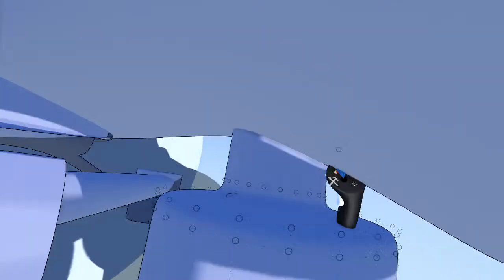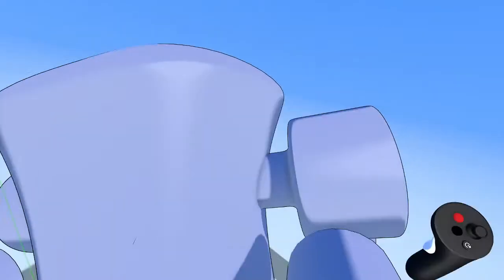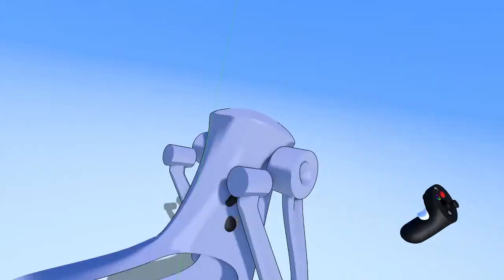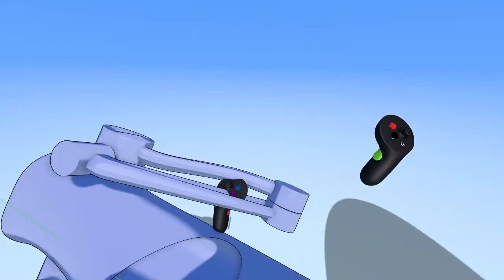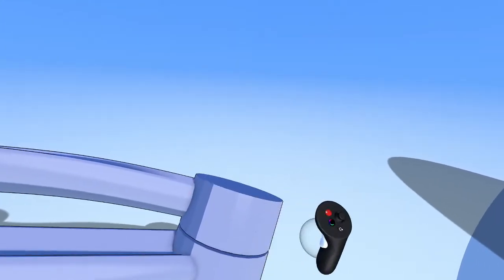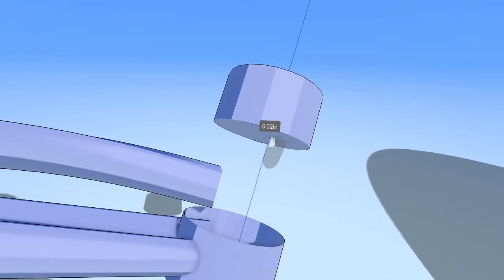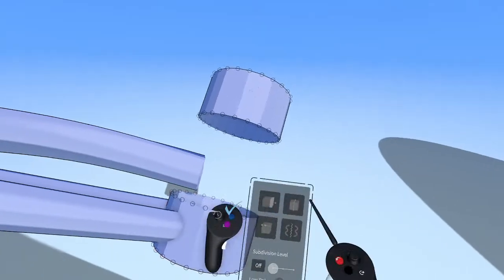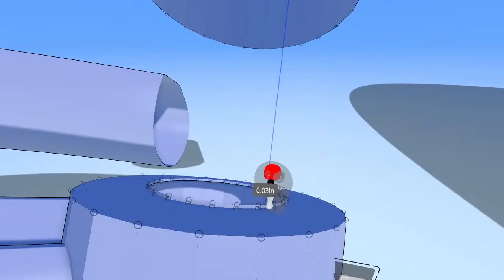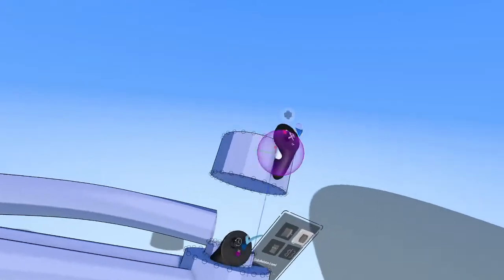All right, and we're not going to worry about flowing things in perfectly. Sometimes in Gravity Sketch, this is enough for a render, is basically just intersecting shapes. Let's do the same thing down here. Just add a bit of detail. And merge these two shapes together. Like that. Oops.